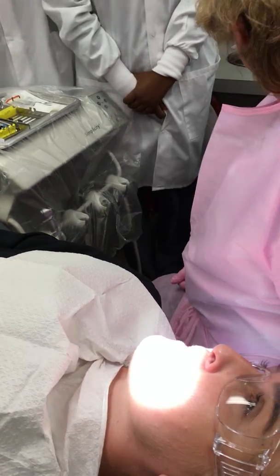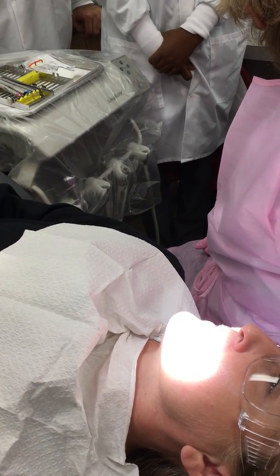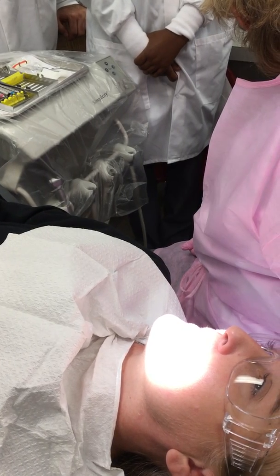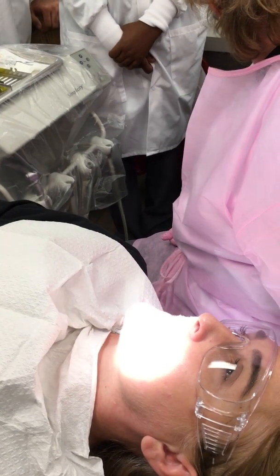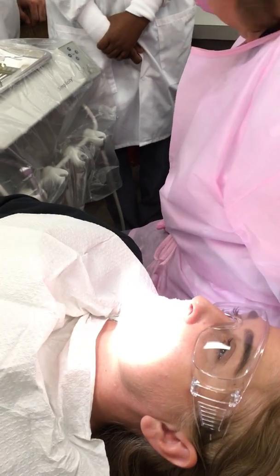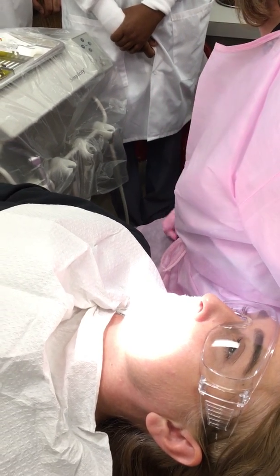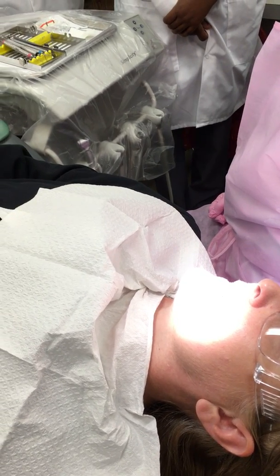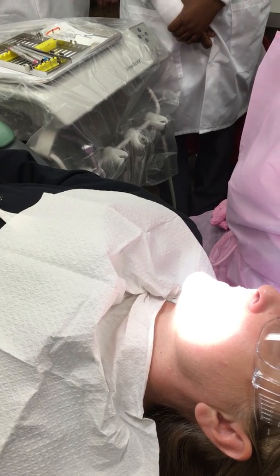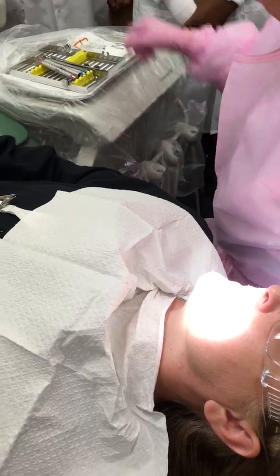Do you think, Ms. Hoffman, those intraoral cameras would show? They probably wouldn't show as well because they've been real blurry. That's because of the sleeves we need; the Action sleeves come with them. You wanna try it? We may have it. You think it'll show the video? We can try it. Well, let's see how we do first. All right. Light's affecting me over here.